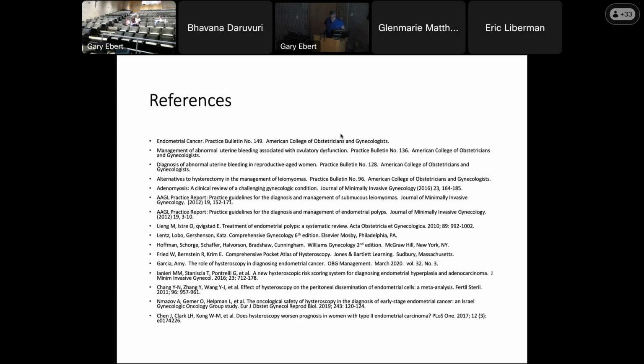Yeah, use the bipolar resectoscope. I guess you could use maybe the MyoSure. I know it has a bigger jaw, but that's a common thing that I hear about being unable to, quote unquote, chew through the fibroid, or if the fibroid is calcified. I've had a lot of patients refer to me after they've been taken for a hysteroscopic fibroid resection. I'm able to do it using the bipolar resectoscope. So I don't really know what could be done using the mechanical morcellators to improve the efficiency of that, though.